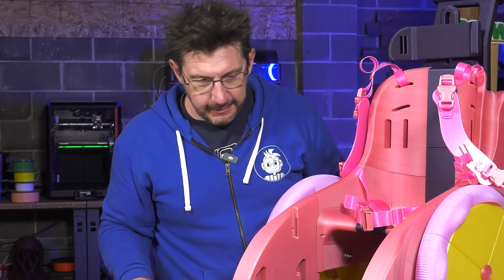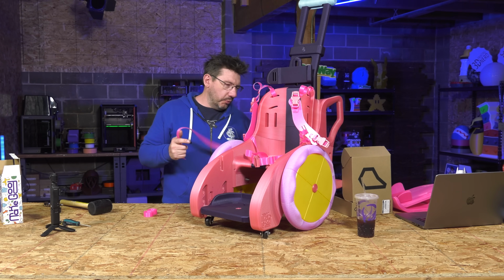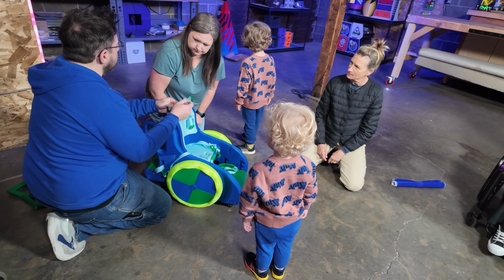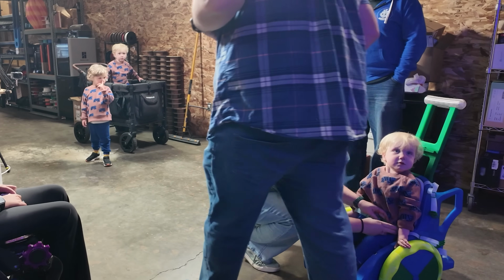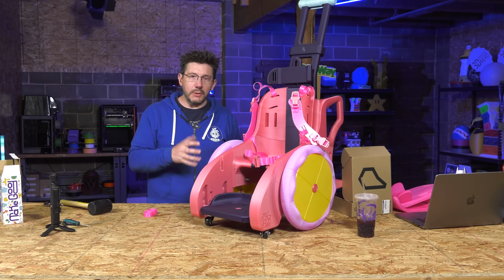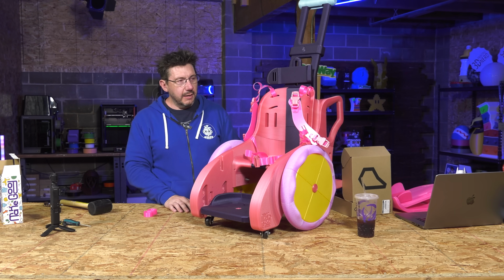The seat belt is in. There are straps that you can put here for the feet. There's a strap and a buckle set that you can loop around the back for accessories. When Waylon and his parents came and picked up the chair, I had it fully built, and they were like, well, can we take this off? Can we take this off? Oh, he won't need this. He just needs a seat belt. And that's part of what's really cool about the Toddler mobility trainer is how much customization and configurability it has.